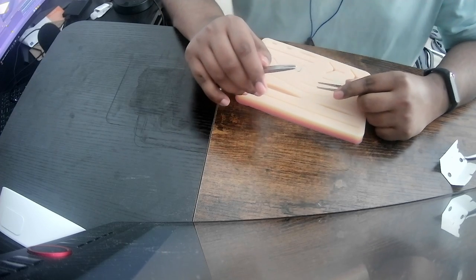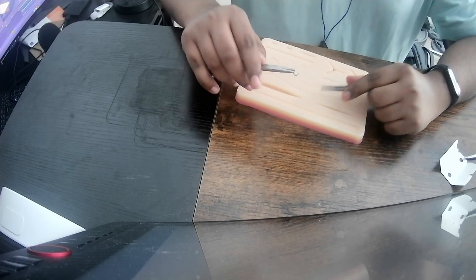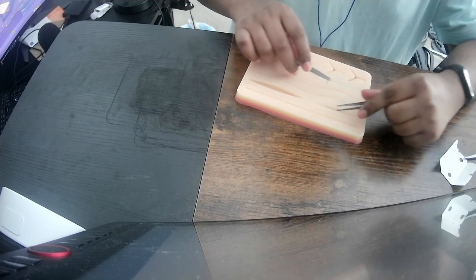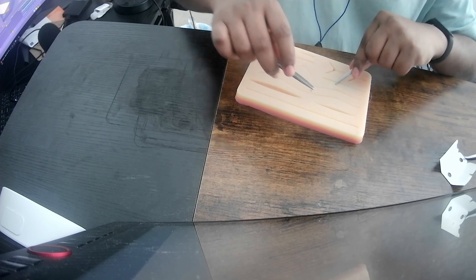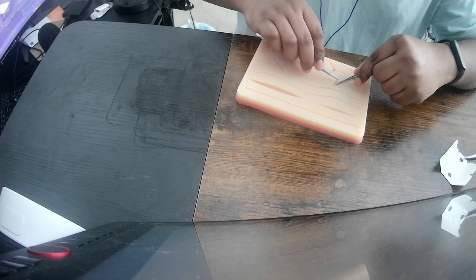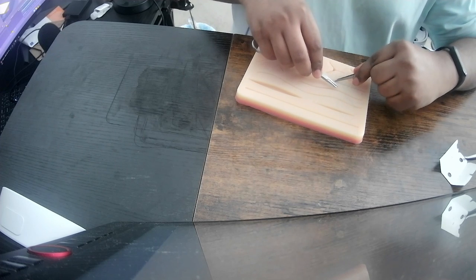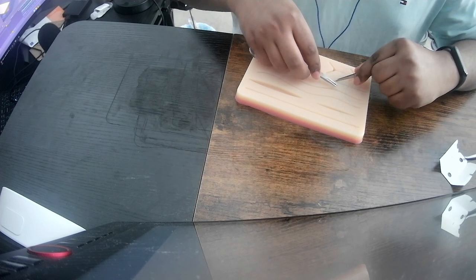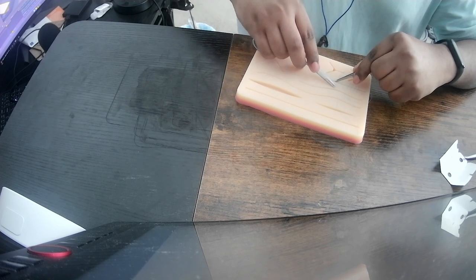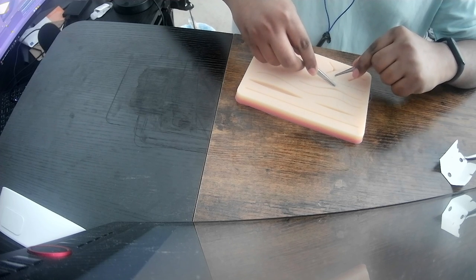Huh, it's interesting. I think every time I dig in too far away from the wound, it doesn't look as bad after I tighten it. Okay. Let's try again. Oh, bad habit again. I'm hunching. But if I don't hunch, how would I know? I guess it just has to be muscle memory. And drive. Huh, okay. That's not too bad, actually.